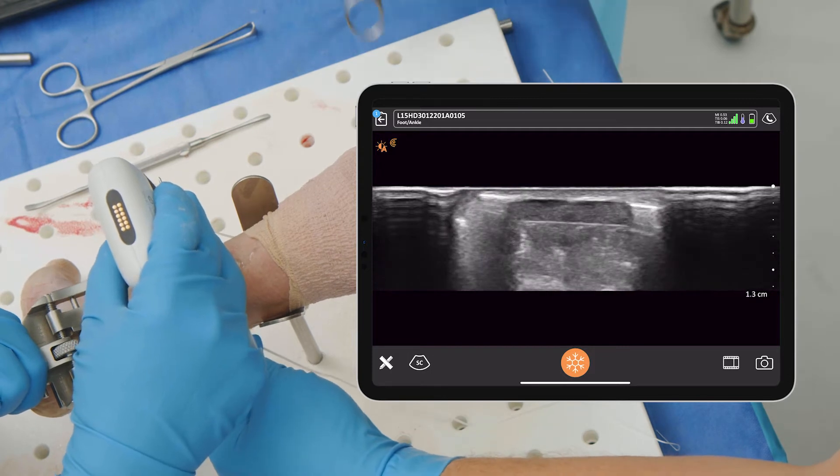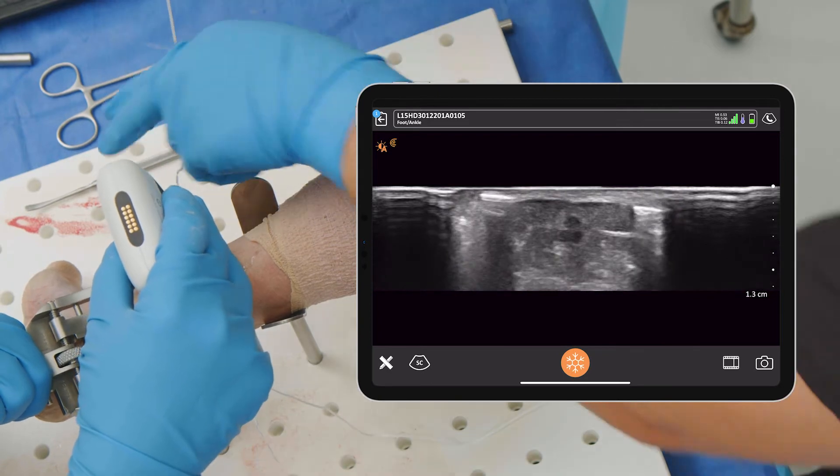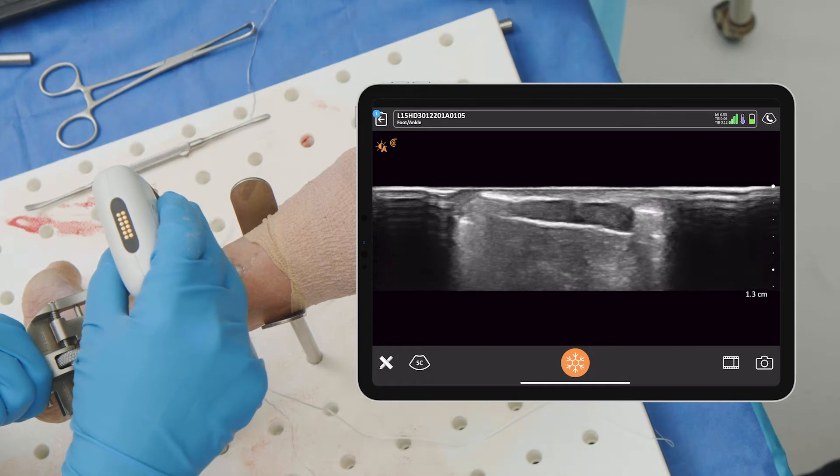Go ahead and pull that out. You can see that suture right in the dead middle of the tendon, right where we want it. Okay, let's go to number three.